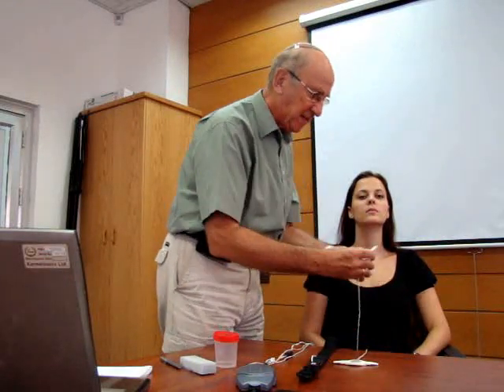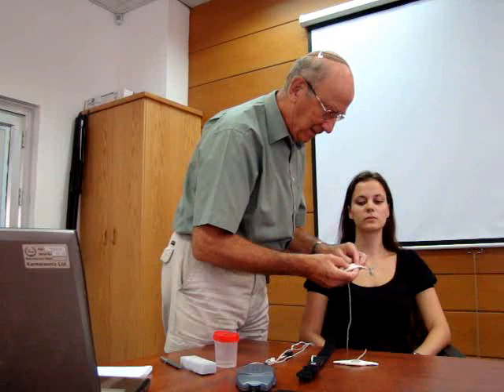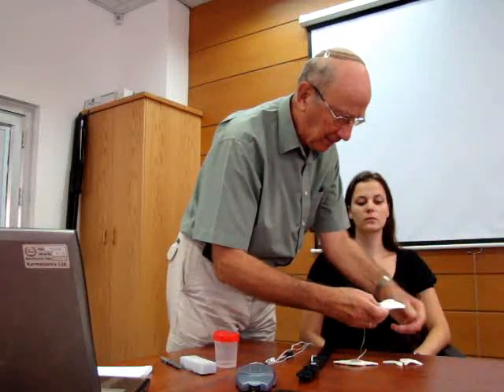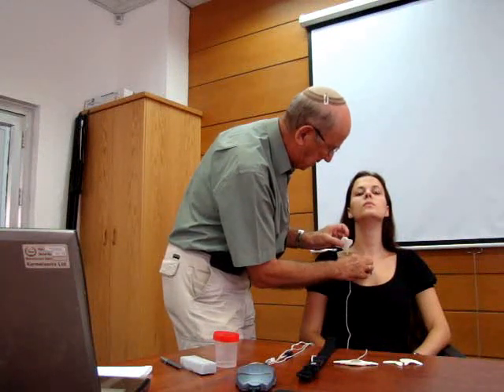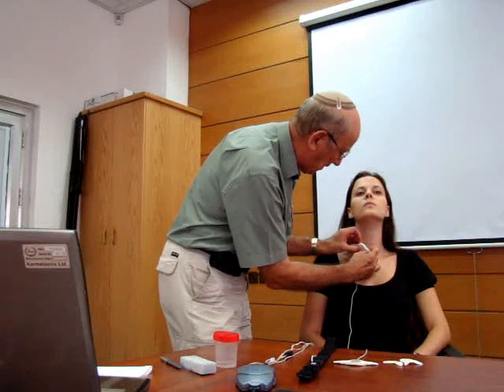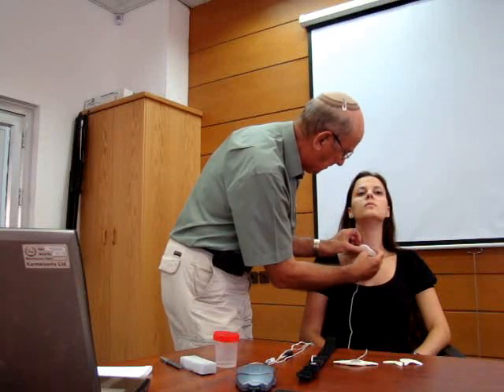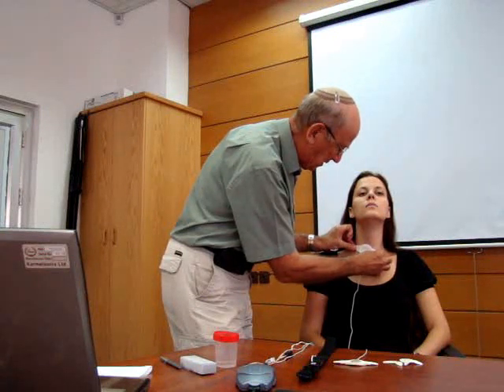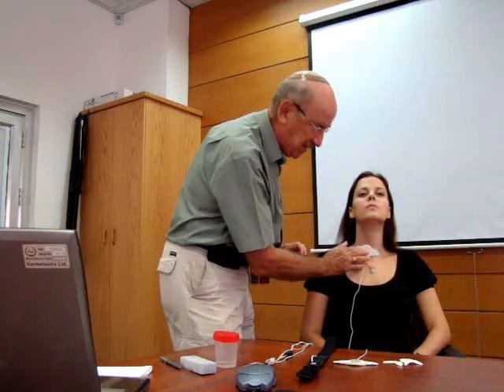I take the sensor for the trachea and peel off the backing tape. I check my landmarks: sternomastoid, midline of the trachea, and I place the edge of that sensor to the midline, anterior to the sternomastoid. Then I apply tension to the two wings of the adhesive backing and connect them so that the sensor is being pressed appropriately against the skin.